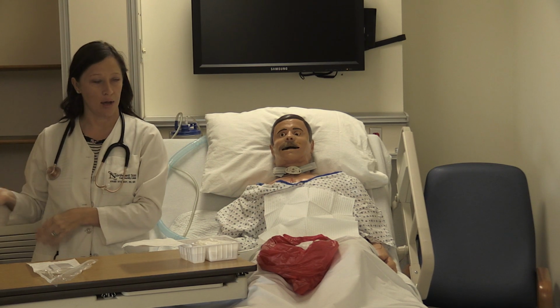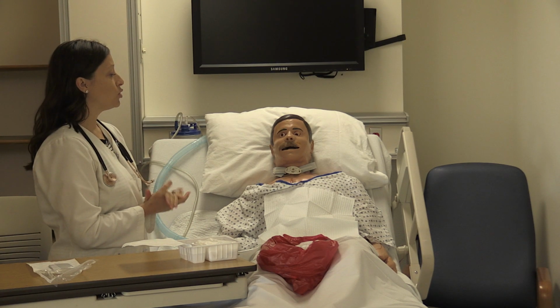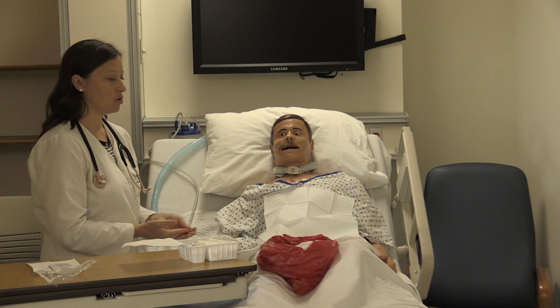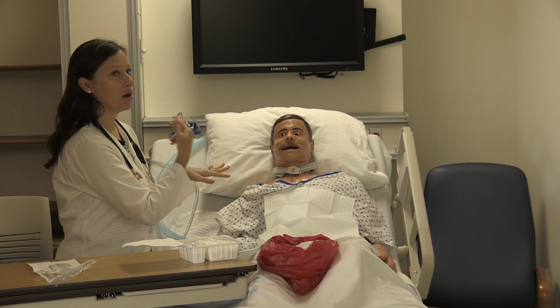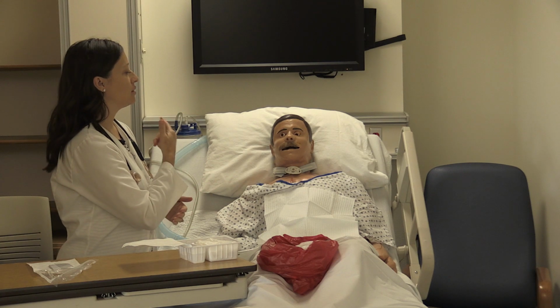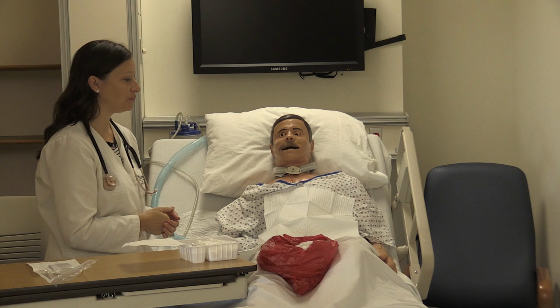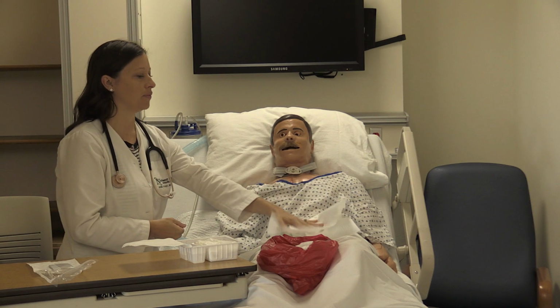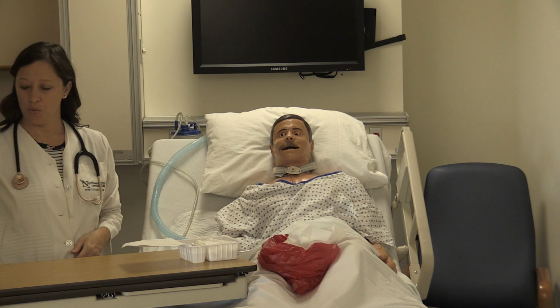And then I do my hand hygiene, and I'm going to get started again now for step 2, which is trach care. So we've suctioned him out, and now we just need to clean around the area around the stoma in case there's any crusties or just anything that needs cleaned up around there. Also, you would have gotten rid of this too. So I'm done with this.